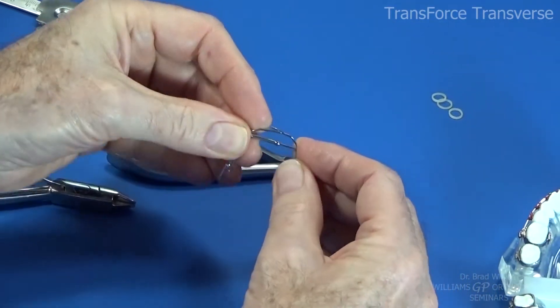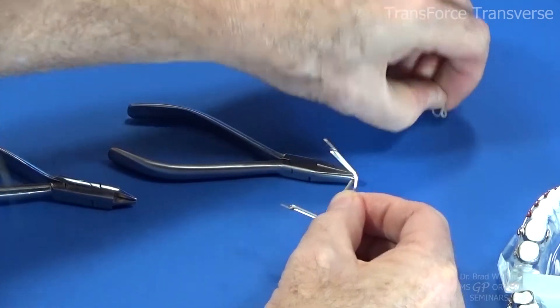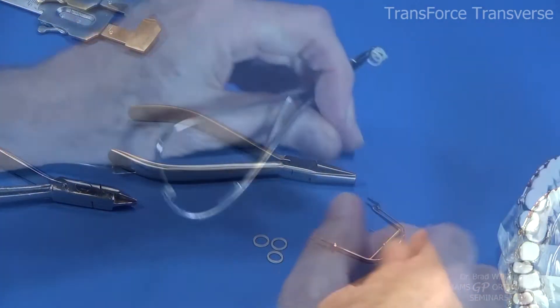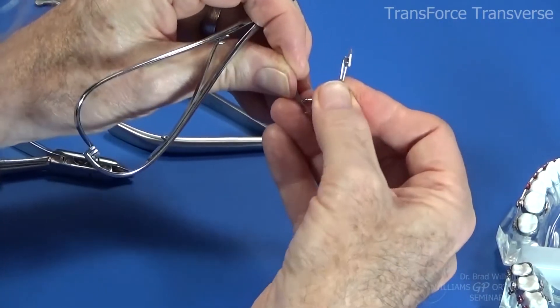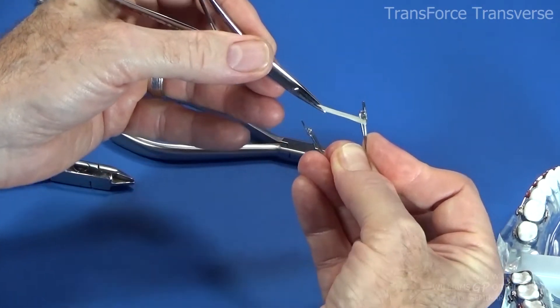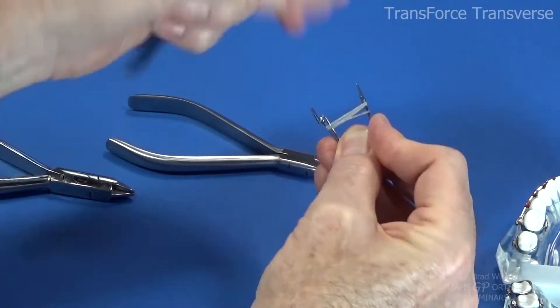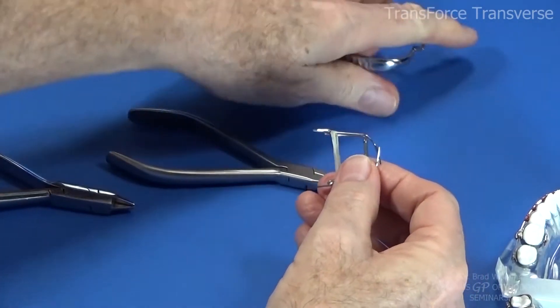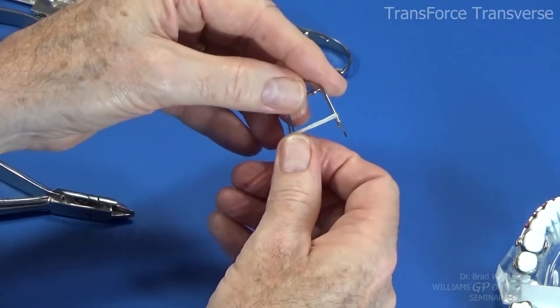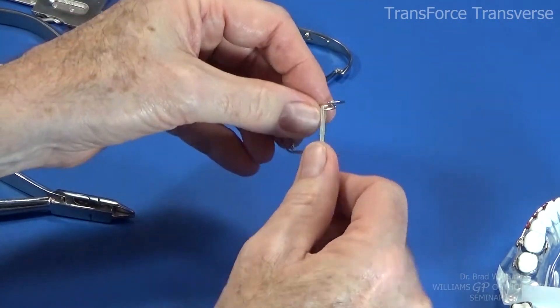Whenever I insert this appliance in the mouth, I always compress it and put quarter inch rubber bands around it. I compress the appliance and put all three of them on like this, then take it back over the other side. This gives me control because it stays compressed. After I get it in place and everything is done, I'll just cut those and it'll activate and go to work.